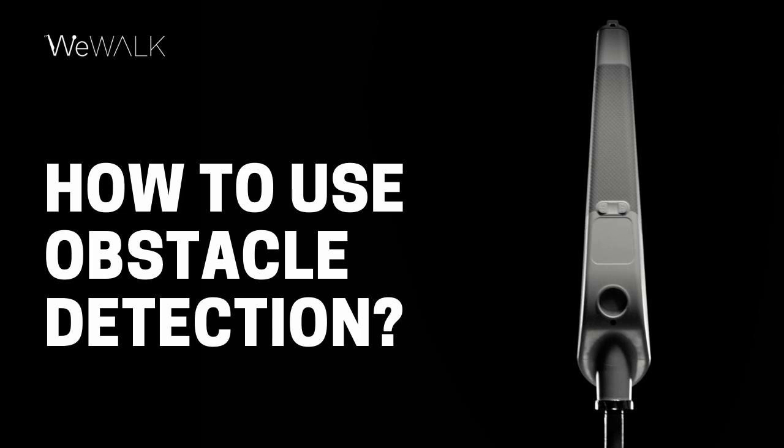And finally, please remember that WeWalk's obstacle detection feature is not a replacement for good orientation, mobility and cane skills. We therefore recommend that you seek orientation and mobility training before solely relying on WeWalk's obstacle detection feature.